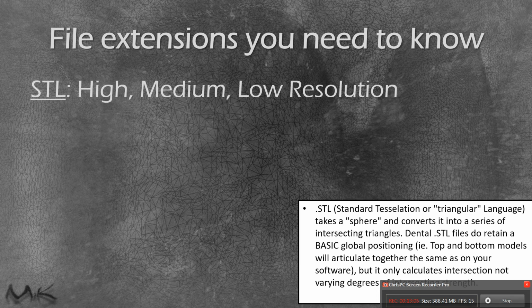So if you look at the back of my PowerPoint presentation, you can actually see some teeth in the background. These are teeth that I scanned, converted into a wire mesh framework, and have them as my PowerPoint background. You can see that mesh intersection blown up about 25 or 30 times larger than the actual tooth that we scanned, to give you an appreciation for what an STL file actually does.